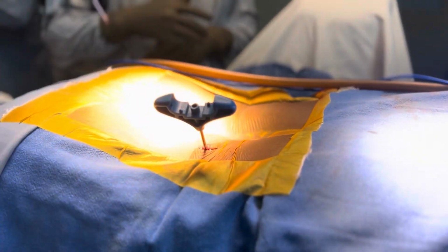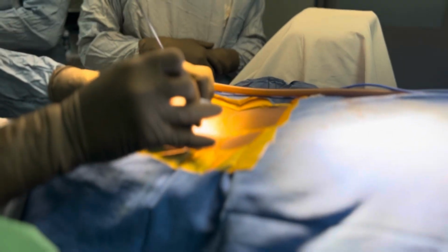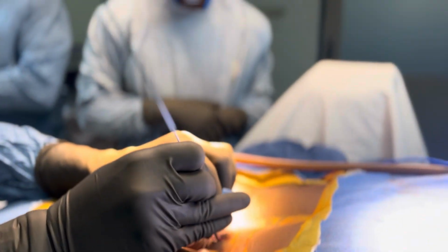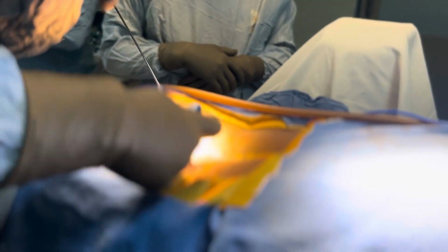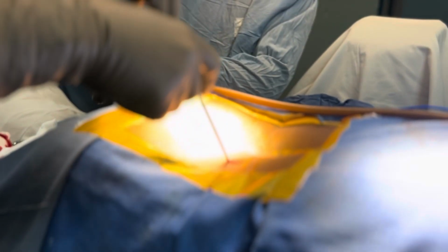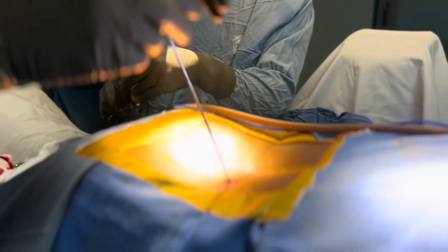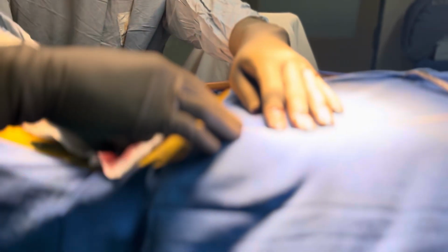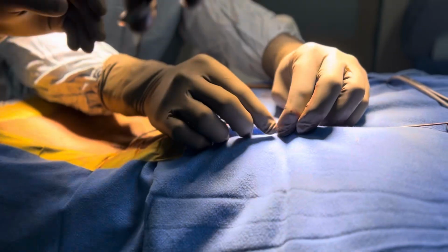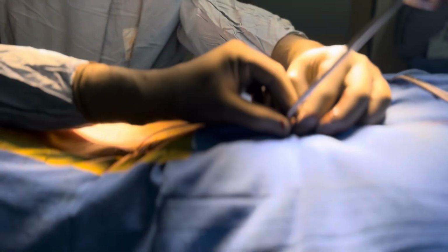Now this is the guide wire being placed through that cannulated needle, and we can put this guide wire till the anterior cortex of the vertebral body. While removing the needle, one should hold the guide wire so that it does not come back with the needle, and we can keep it aside till we do the interbody work.